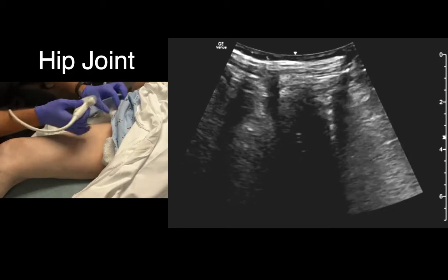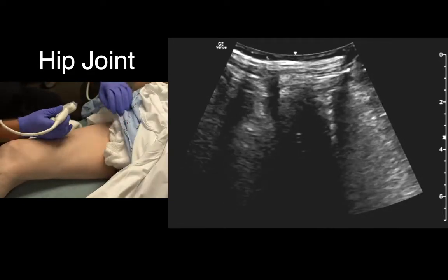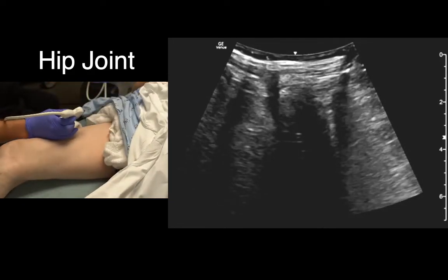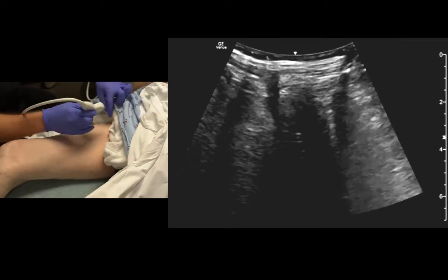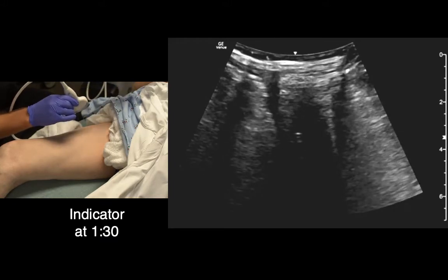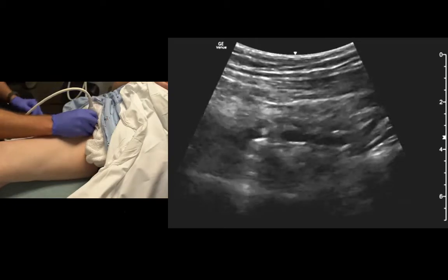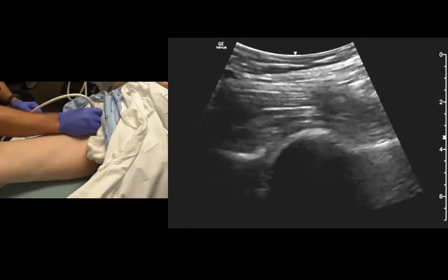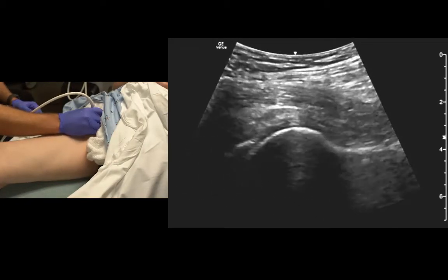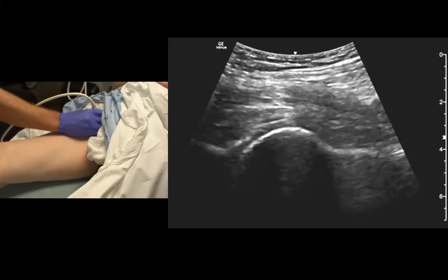We want to be right at the midpoint between the anterior superior iliac spine and the pubic symphysis — about right in between those — with the indicator roughly towards the patient's umbilicus. What I like to do here is place it almost right in the inguinal crease, and we'll identify the round femoral head.